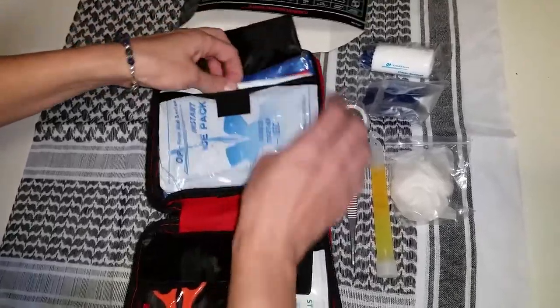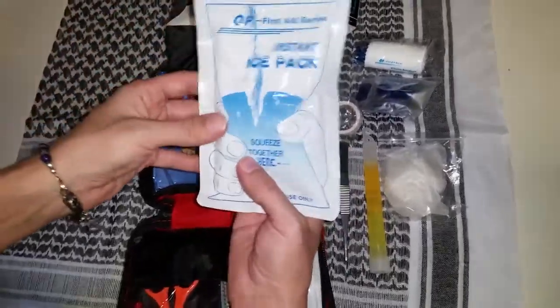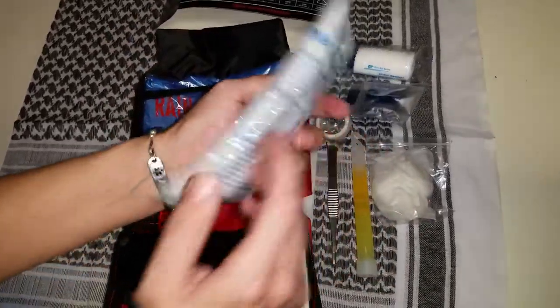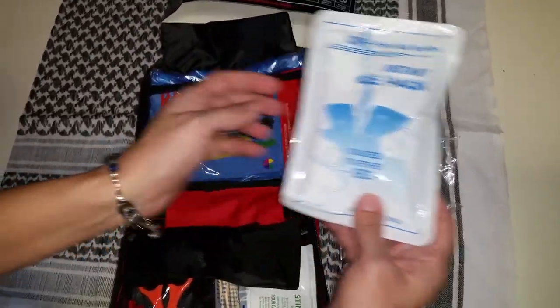Instant ice pack, and it's a good size too. All you do is give it a good snap and that will activate it. That's a one-time use.